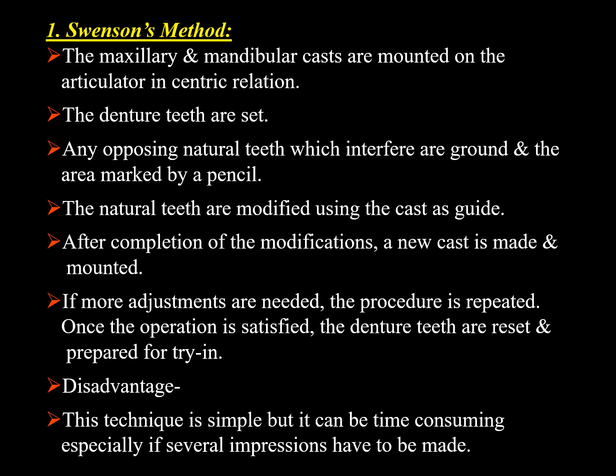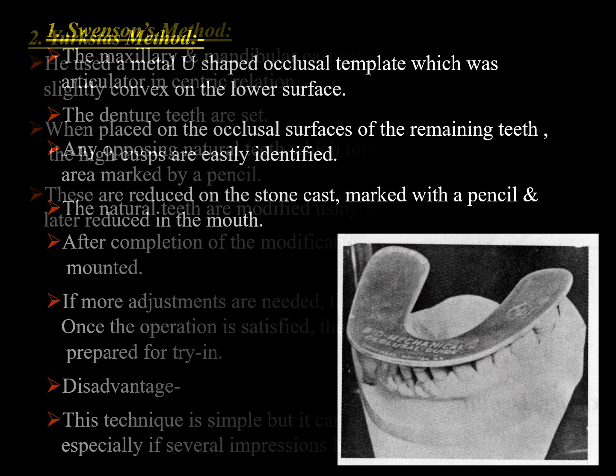The disadvantage of this technique is that it is simple, but it can be more time consuming because several impressions have to be made in case the procedure is incomplete or deficient.